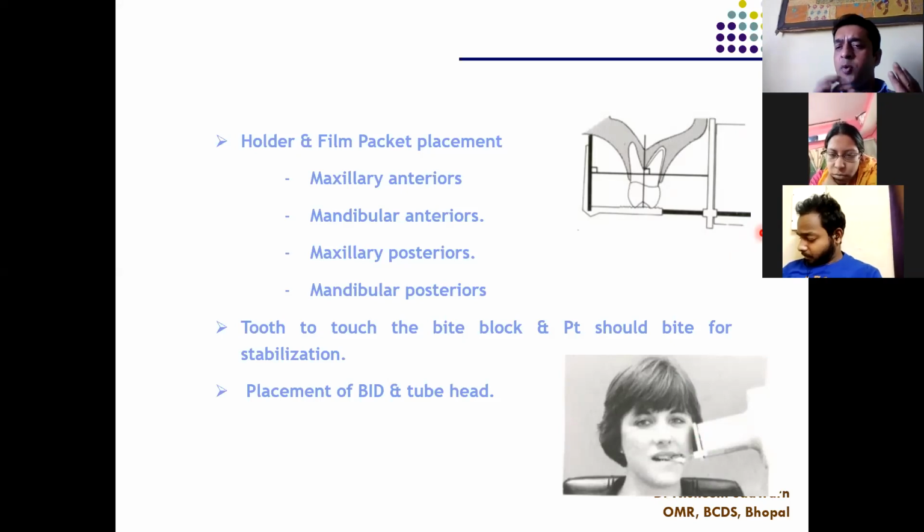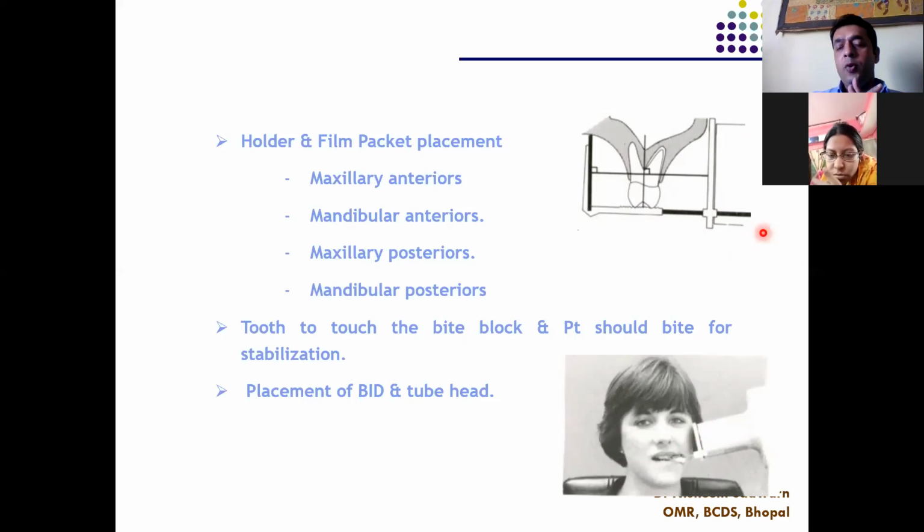You will always get a good quality radiograph because there is no human intervention. Means your brain is not required to be used there. The machine will tell you everything about how to make the radiograph. So we end up with a good quality radiograph, easy to do, not technique sensitive.